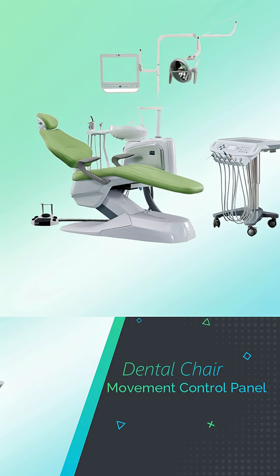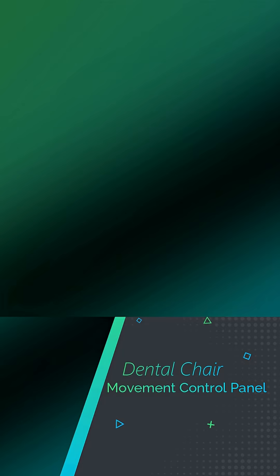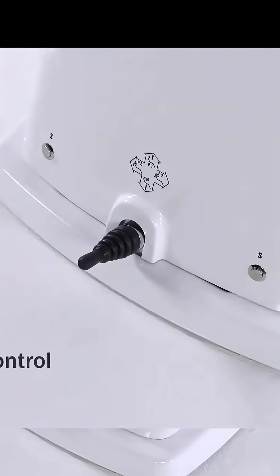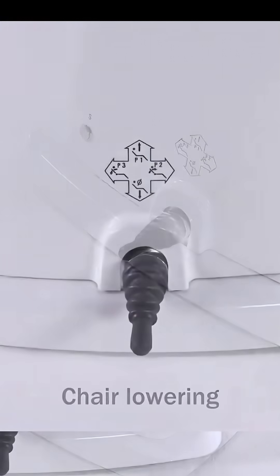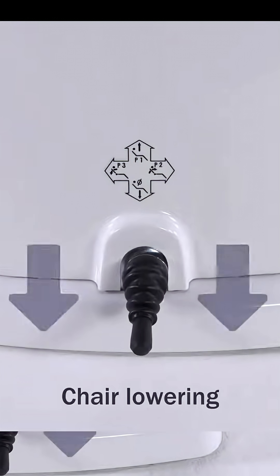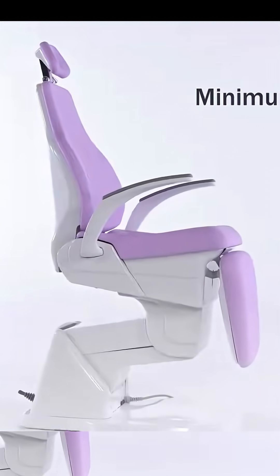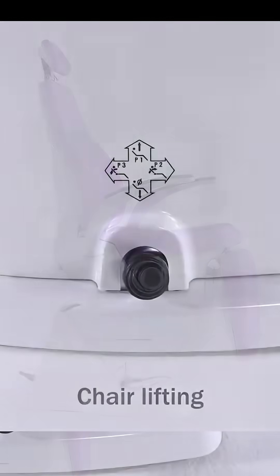The second component is the dental chair movement control panel. Dental chair controls are comprised of control buttons that can move the dental chair upward or downward depending on what is best suited for the clinician. The movements available are: move up, recline to rest, move down, lie down, lift, and raise the seat.